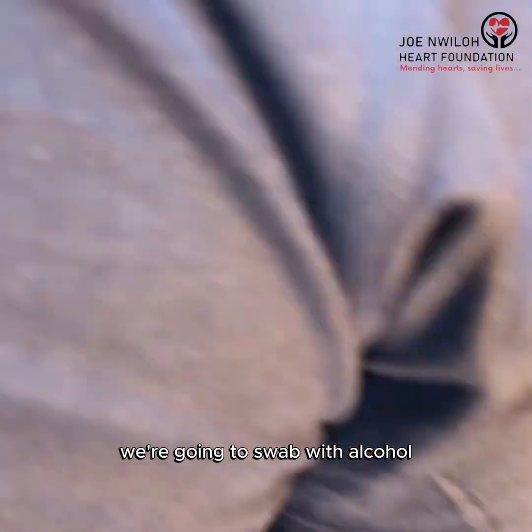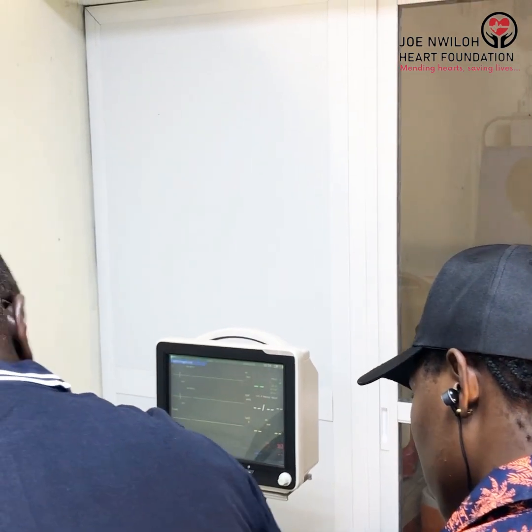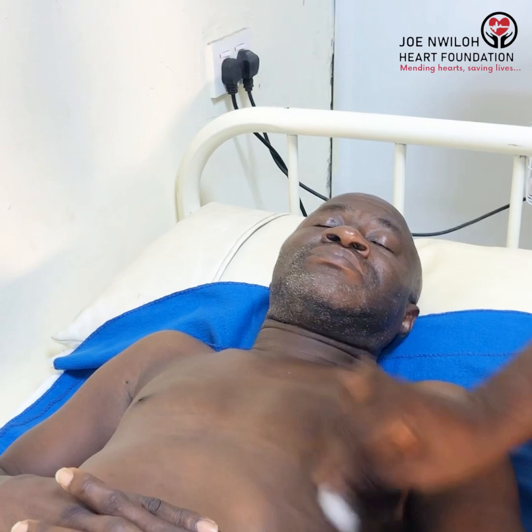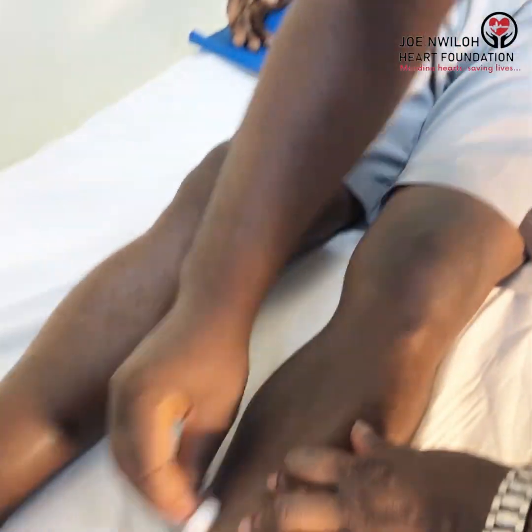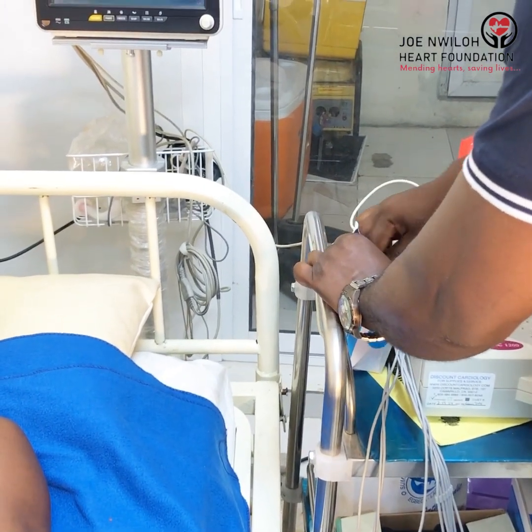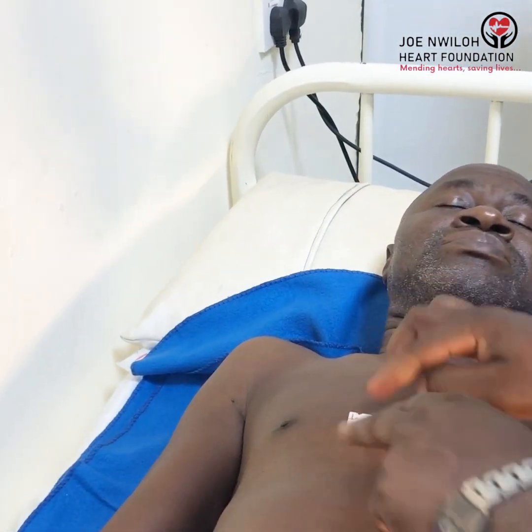So the first thing now, we swab with alcohol, so we have good electrical reading. So this way. So these are the electrodes. So we stick the electrode on the chest, fourth intercostal space.